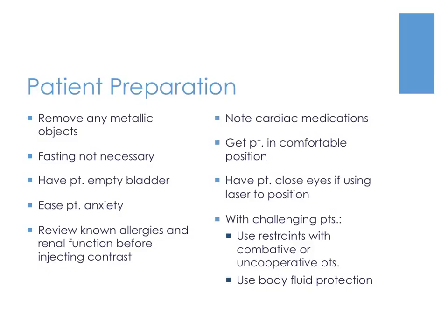Note cardiac medications, which is especially important in cardiac imaging and CTA imaging because it usually shows signs of any abnormal cardiac output. Get the patient in a comfortable position and have the patient close their eyes if using the laser to position, and use restraints or body fluid protection with combative patients.